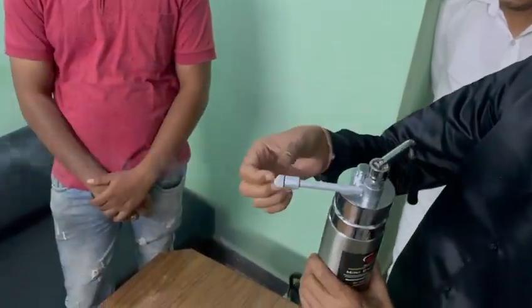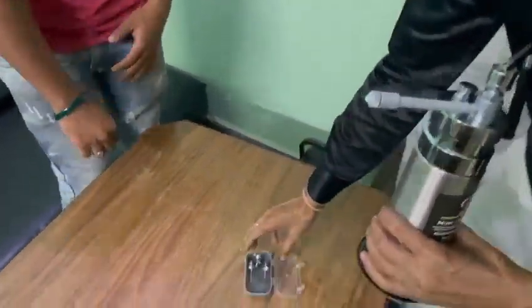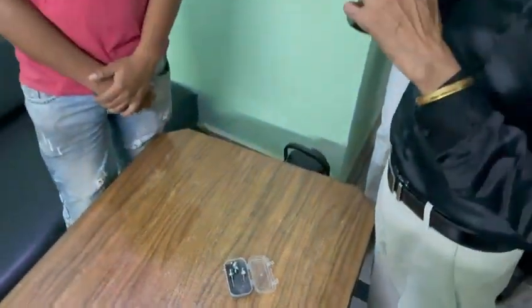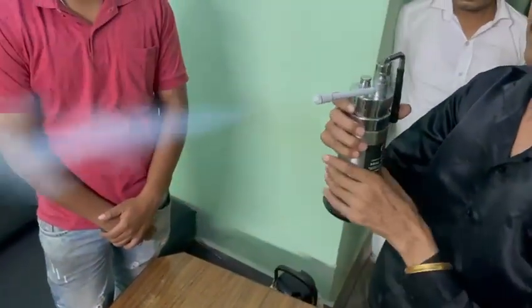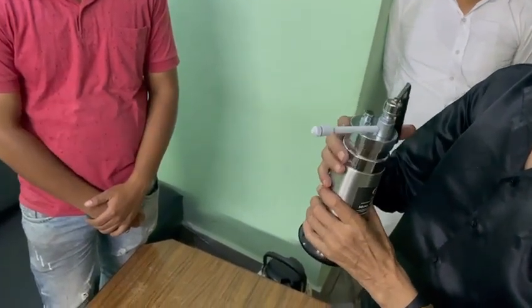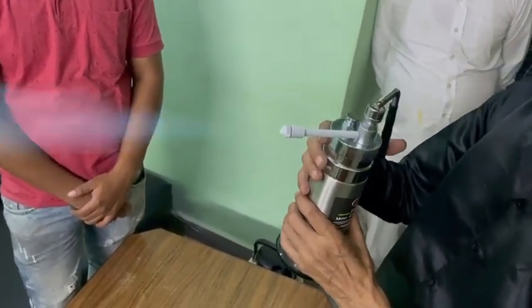You can also change any tip. We have 5 types of tips available. This is a live demonstration of the liquid nitrogen cryogen.